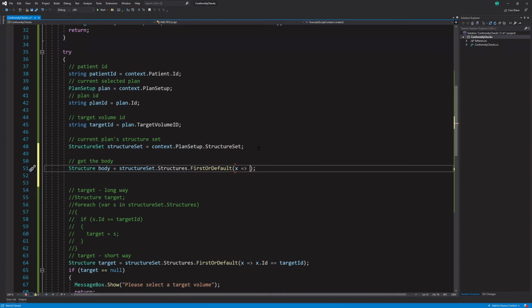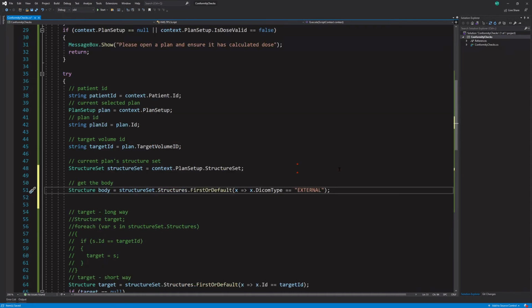We won't do this a long way, but we want the DICOM type equals, I forget, I think it's just external, and I think it's all caps. I can't remember. We'll have to check. It could just say body, but I'm pretty sure it's external. I can't remember. Let's hover over. It might tell us. PTV marker, of course not.